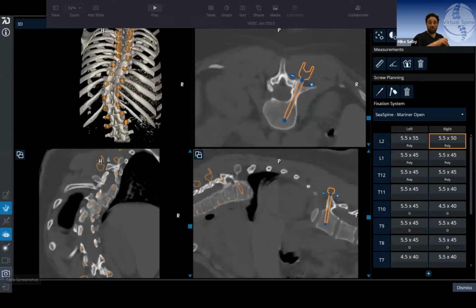And this is another part of the tech, and this goes with robotics, and we've talked about this a lot on this platform previously, but this is screw planning. It's not just about telling people what you need; it means you can start getting things out in advance, or as we move towards a world of pre-packaged screws, we can have everything ready to go.